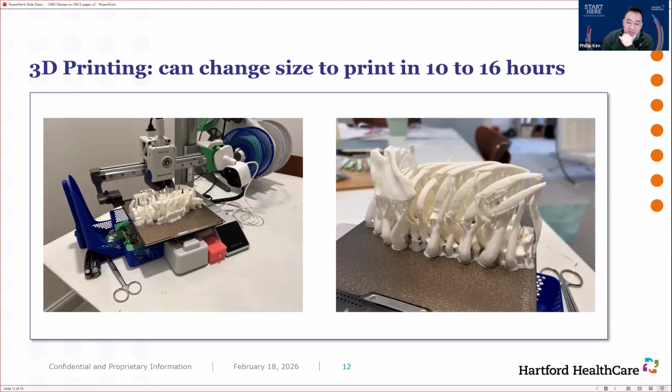Then you can get rid of all the lateral tree supports, at least the ones that are not holding the fracture fragments. I would keep the ones holding the fragments, because otherwise the fragments will fall apart, since there's nothing attaching the two ribs together.